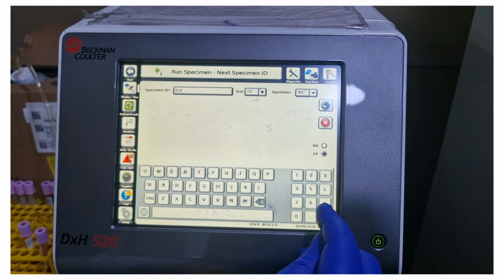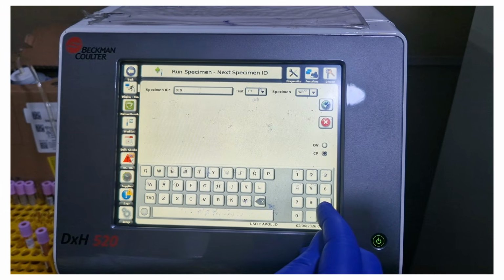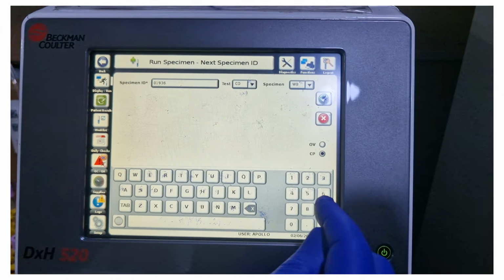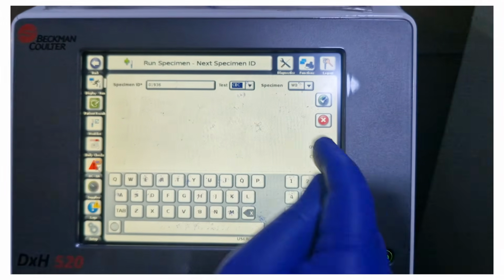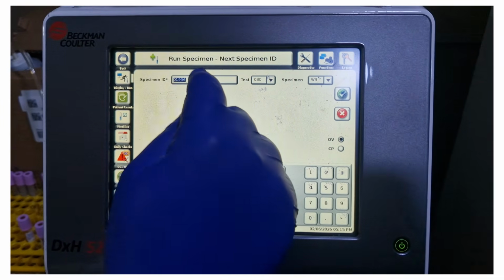Using a Coulter automated cell counter, we will do the CBC of this given vial, and check for the red blood cell and the white blood cell contamination and platelet count of this bag.